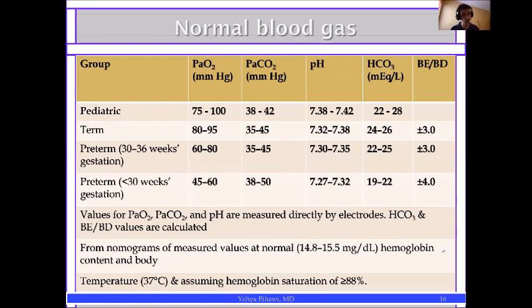And look at your temperature, and whether the patient is febrile or has a low temperature. It's very important to remember these numbers when you comment on a normal blood gas.